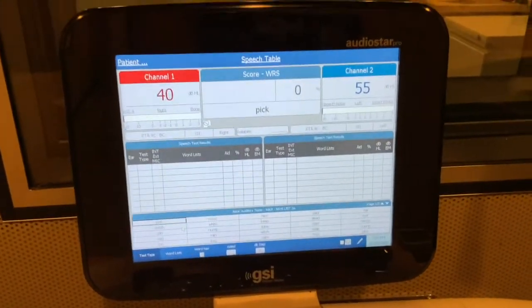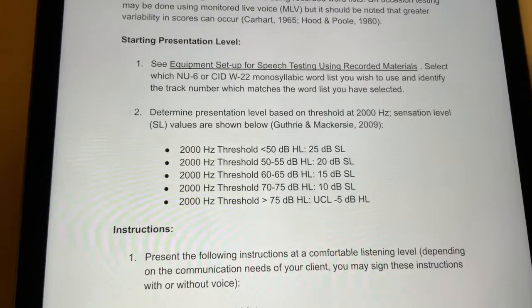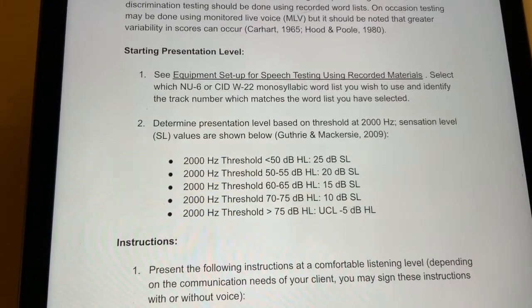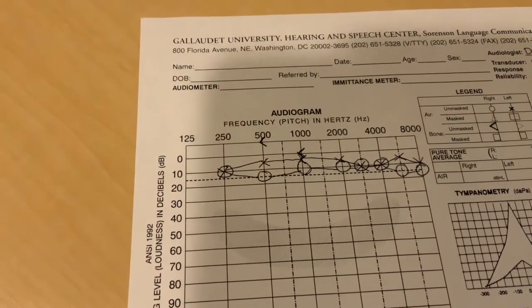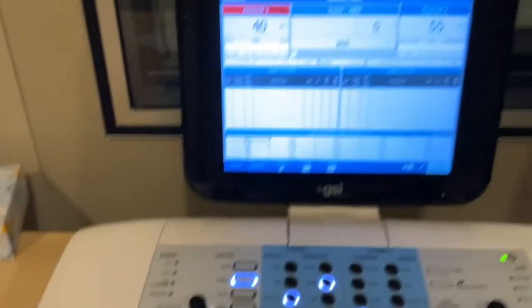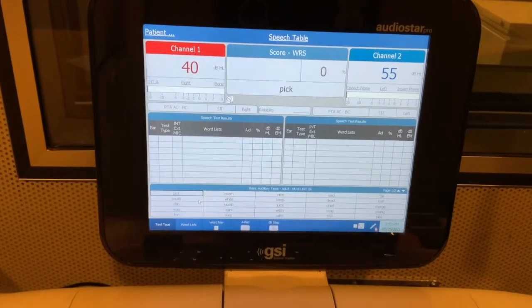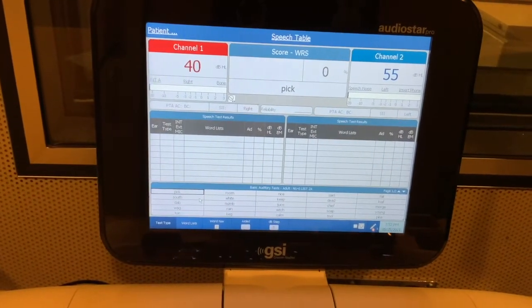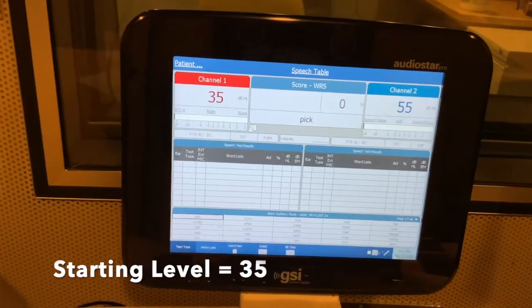The starting level for WRS is associated with the threshold found at 2000 Hertz. As we can see on our audiogram, at 2000 Hertz, we have a 10 dB HL in the right ear, which is the ear that we are starting with. According to our practicum manual, we should start 25 dB SL above that, so we are going to start at 35 dB HL.